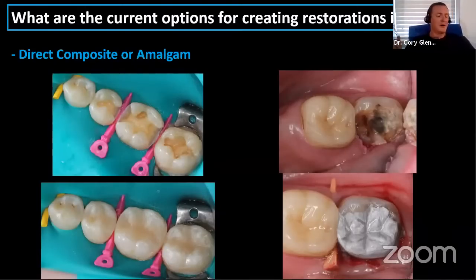I think there's a few more coming. Ceramco's Crown Tech, Envision Tech's got one. I forget their name for it, but these materials are super exciting and they really do an excellent job. I've been incredibly impressed with the results. Again, I'm not clinically practicing anymore, but I am doing these for other people and they're testing them out for me. As an example, I've printed a crown out of this material and then stood on it with my boot on a concrete floor without breaking. So that says a lot.